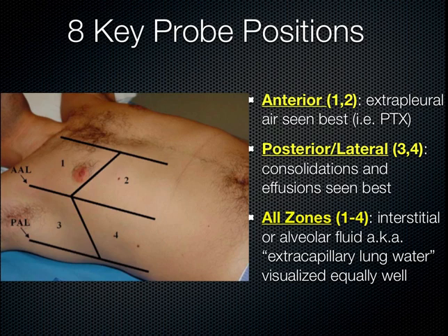It's important to scan all eight lung zones to evaluate for a complete chest exam — two anterior and two posterolateral lung zones on each side. All zones should be equally evaluated, taking but a few seconds each. Anteriorly is the best place to look for pneumothorax in a supine patient, as extrapleural air collects there. Posterolaterally, we can best see consolidations and effusions due to gravity dependence. In all zones, extravascular lung water — such as in diffuse pulmonary edema — should be equally visible.